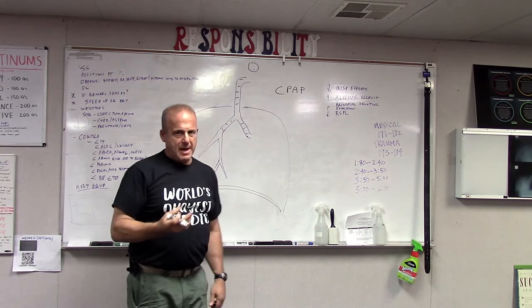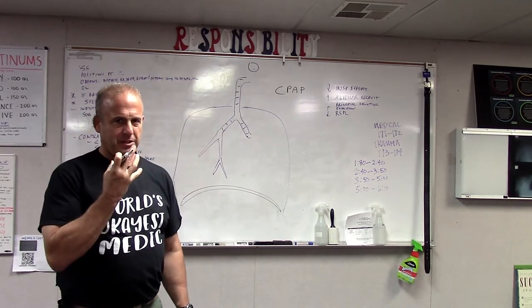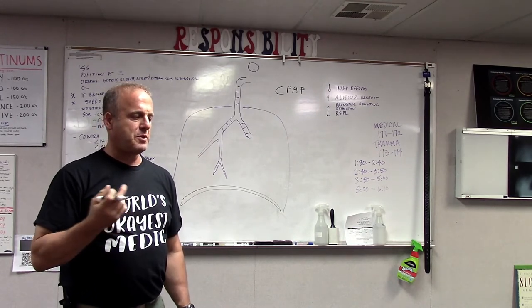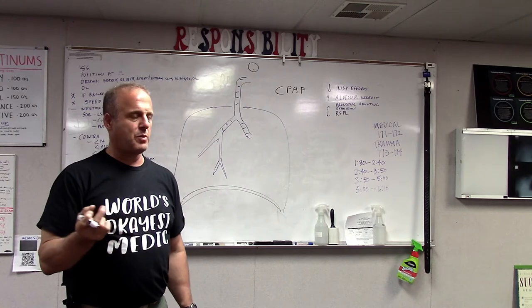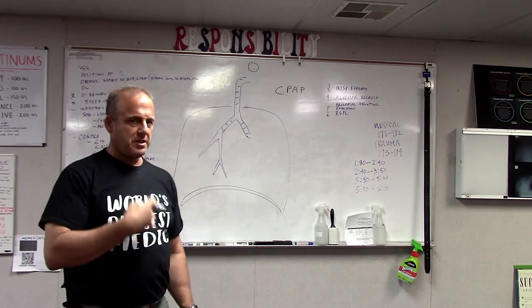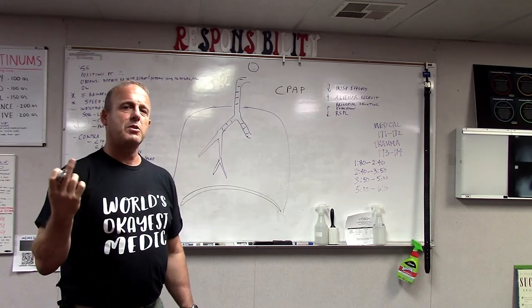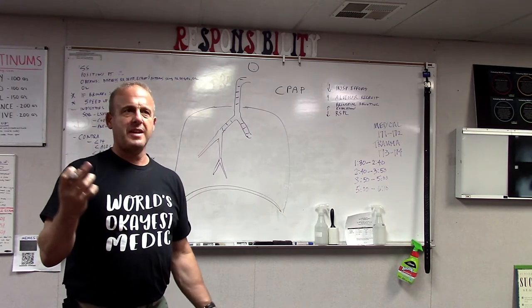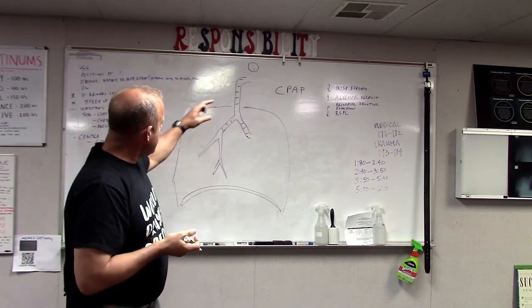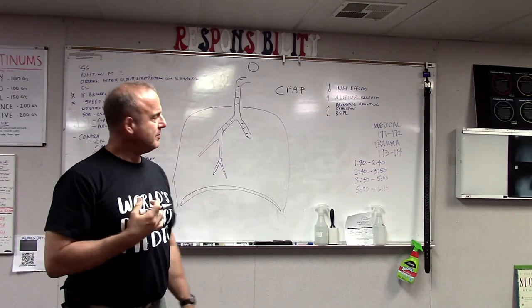When we apply CPAP, we have air being pushed in through the mask to the face. A typical pressure is between 5 centimeters of water and 20 centimeters of water. It can go higher. That air is constantly coming in. It almost feels like having your head outside the window of a car or just standing and facing the wind. That air, as it comes in, may help you take a breath a little more easily.